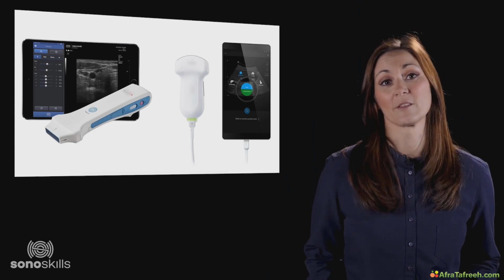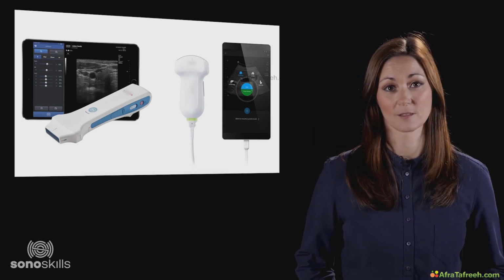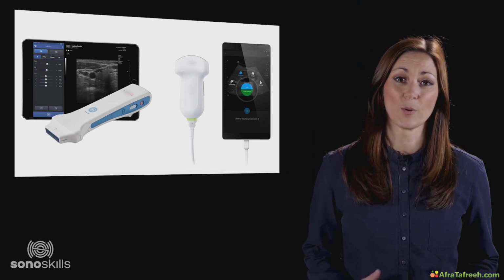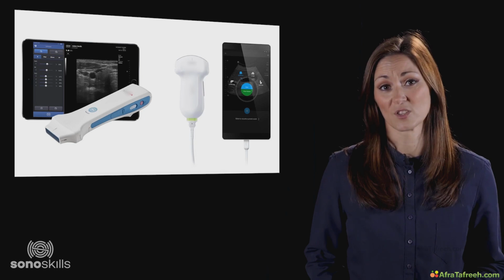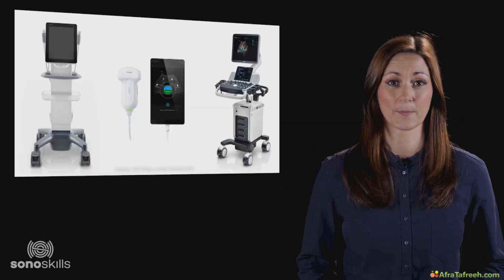Our worries are not about the device itself. We feel that the device is a big step in the future of mobile scanning with a smart device. Our worries are more about the professionals using it, that they will overestimate the device and will perhaps make definitive conclusions about clinical matters for which the device is not yet suitable. Always know your own and the device's limitations.